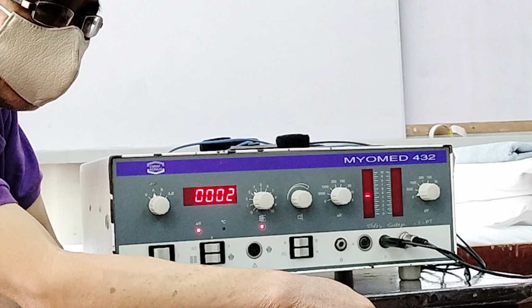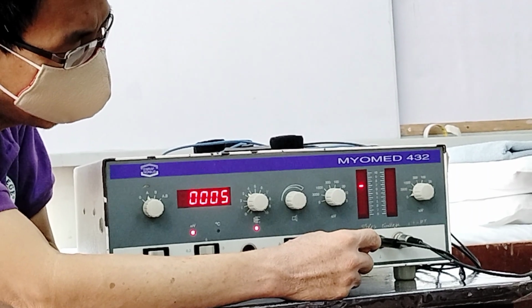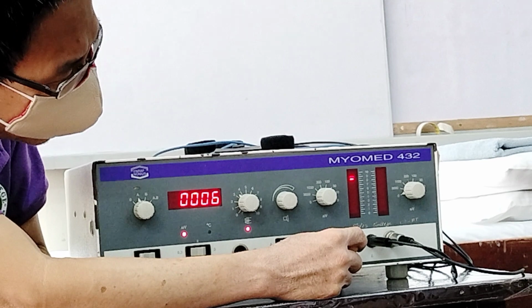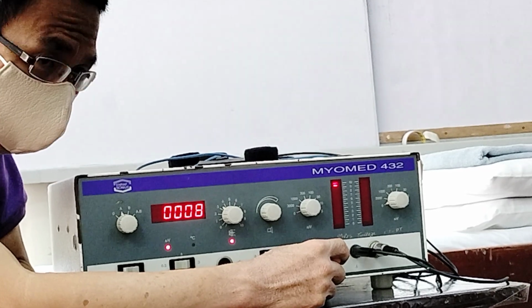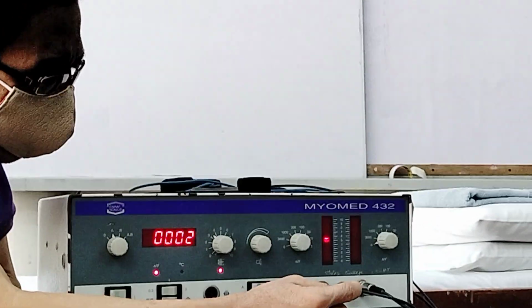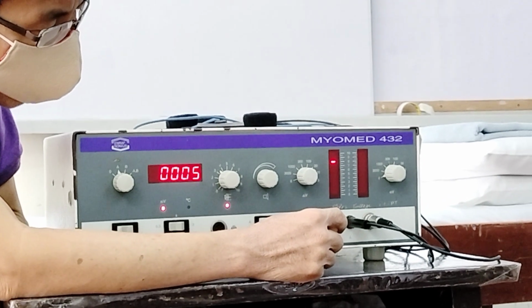After resting, so sige sir ha. Start na sir. Bend, bend sir. Bend the wrist sir. Hapit na tayo mabot sir. Okay, so there. Very good sir. Naka-reach na ka sa 9. Good. Okay? So rest. Again, sir, I want you to bend again the wrist sir. Bend pa yun sir. Up to level 9 again sir. Up to level 9. Alright.